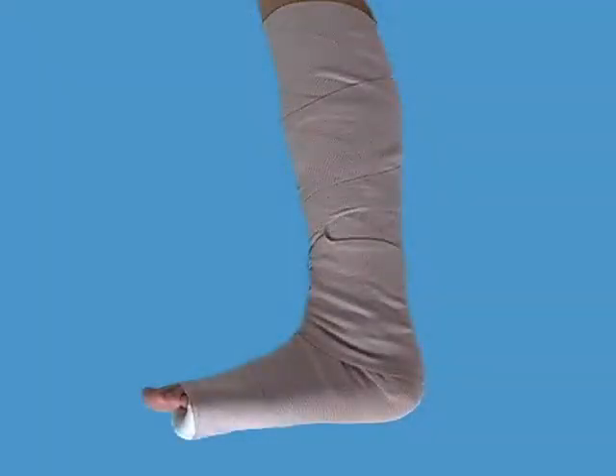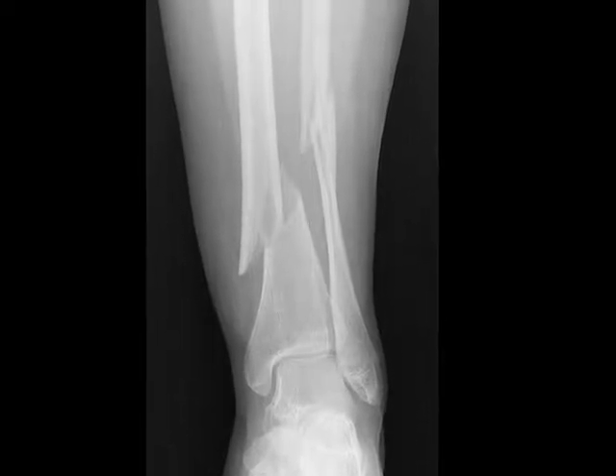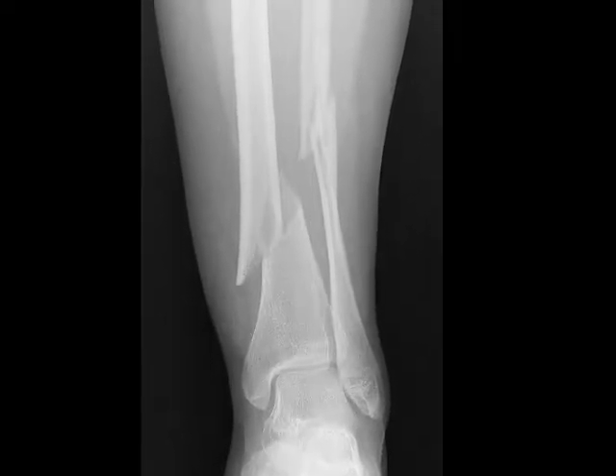The short leg splint is used to immobilize the distal tibia, ankle, and foot. This radiograph demonstrates a displaced fracture of the tibia and fibula.